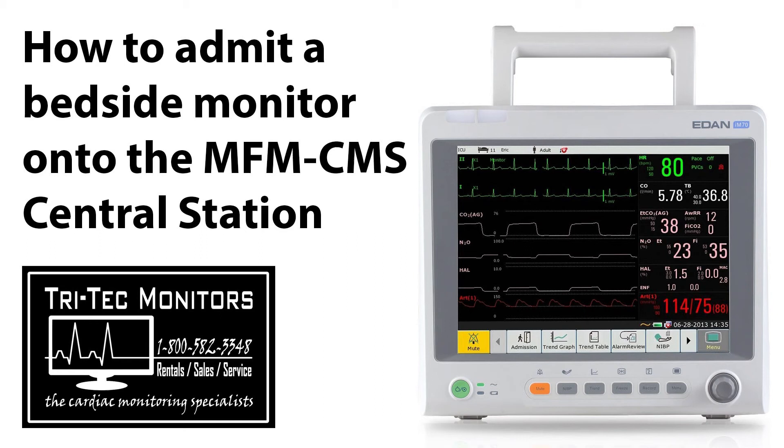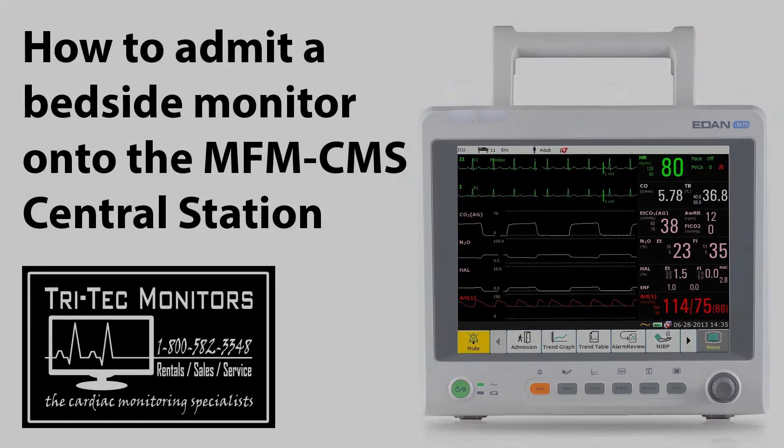Hello. I'm Tim the Tech Guy for Tri-Tech Monitors, the Cardiac Monitoring Specialists. Today we are going to learn how to admit a wireless bedside monitor into the MFM-CMS telemetry central station.